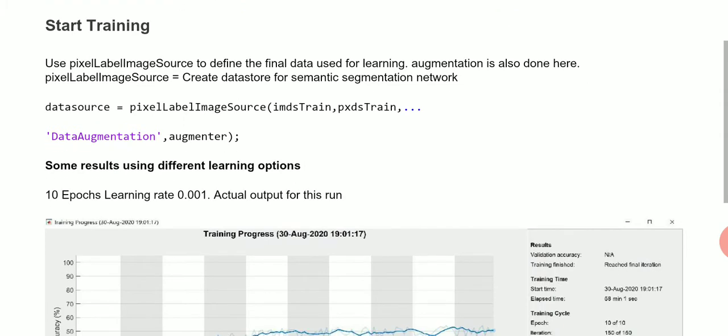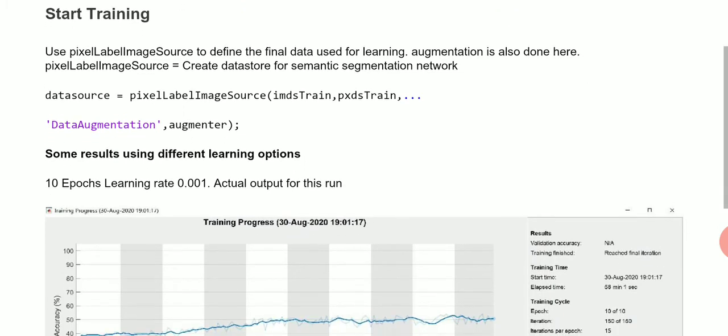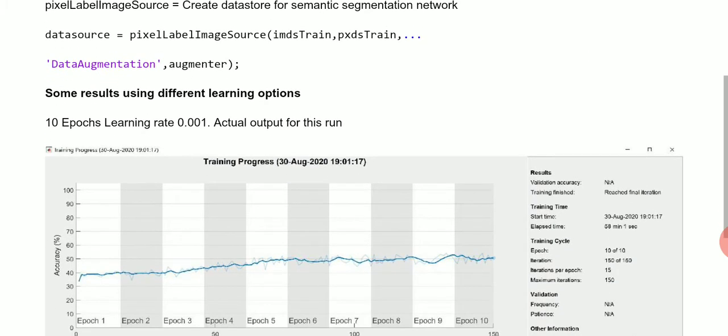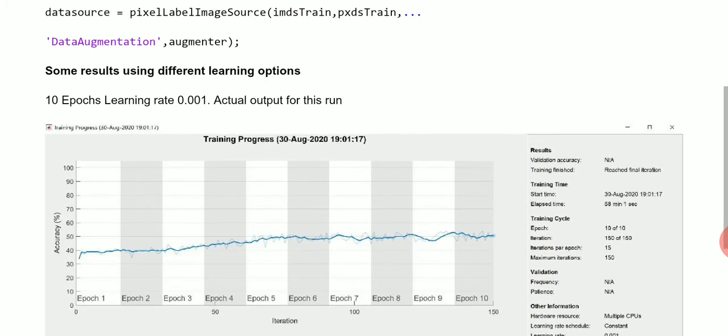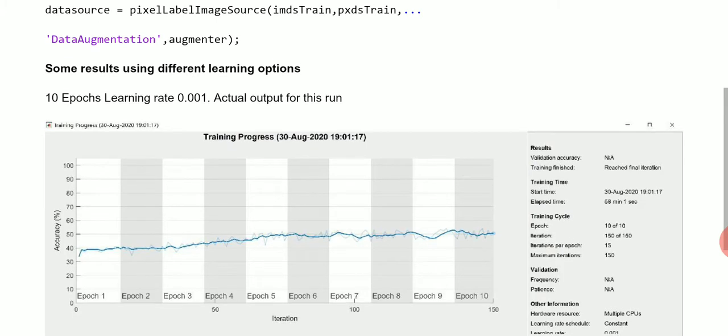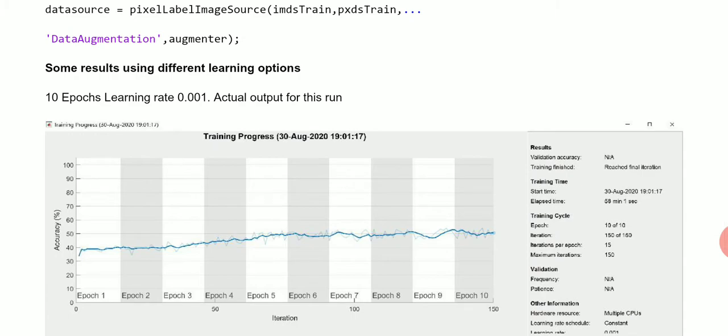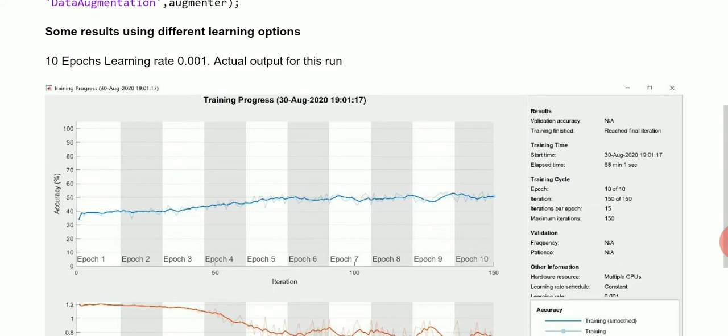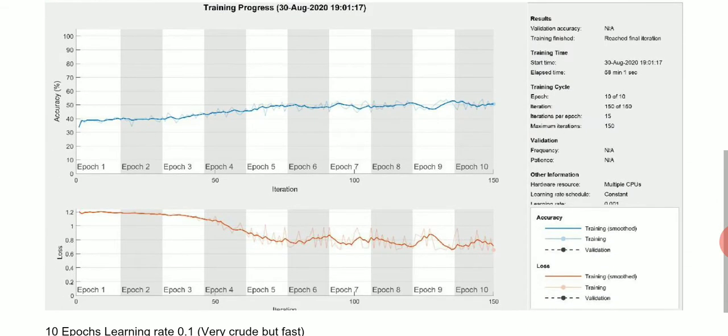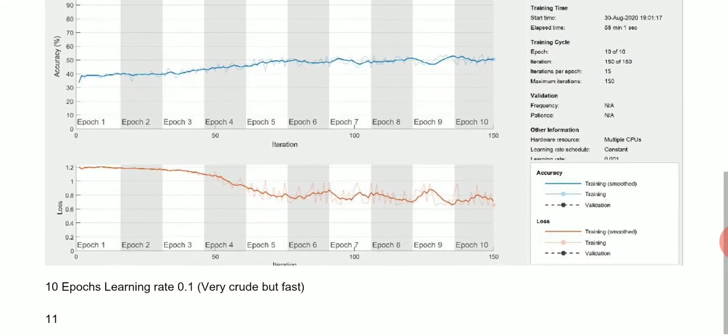We start the training, and this takes quite an amount of time. That was 10 epochs and the learning rate of 0.001. That took quite a while. You can see a recording the 30th of August, just under an hour there. The accuracy is around 50% and there's the loss given there.